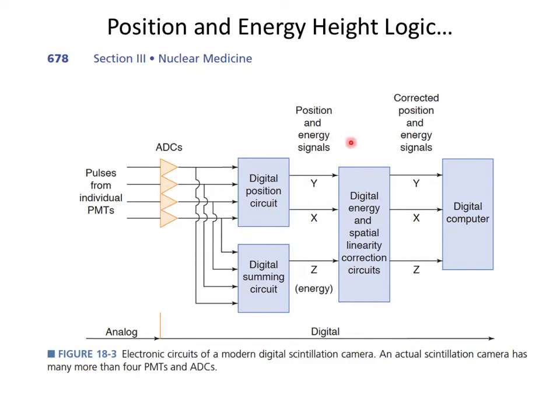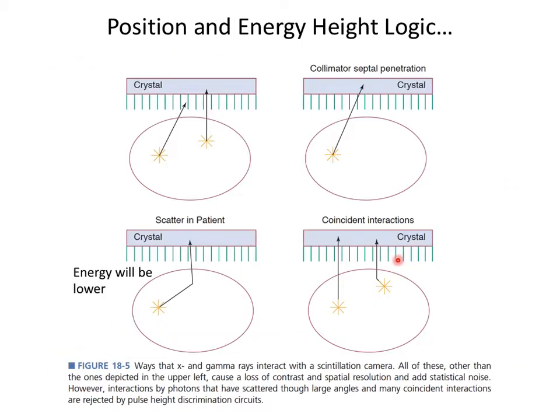And so now, this is cool circuitry that actually worked in the whole era of continuous electronic circuits versus digital. But now we put in this signal to trigger whether or not it's an event inside our energy. These signals give you relative position, and then you just start adding them up on a digital computer to make a picture.